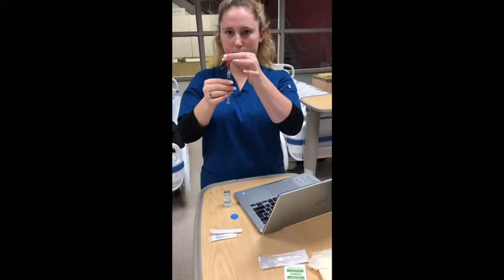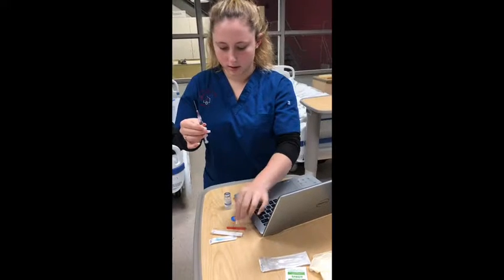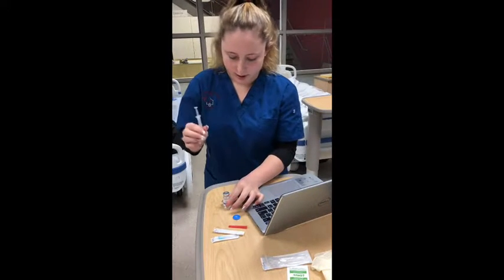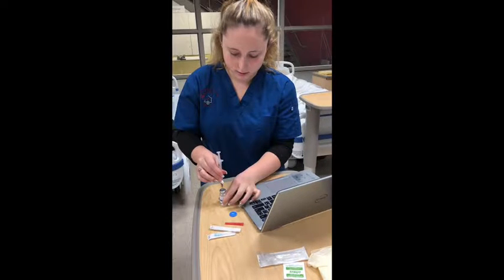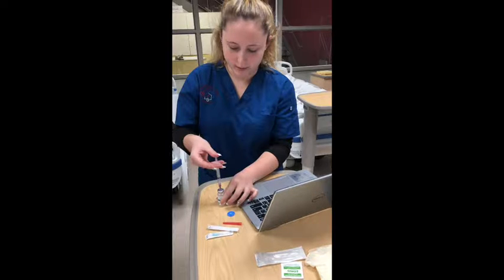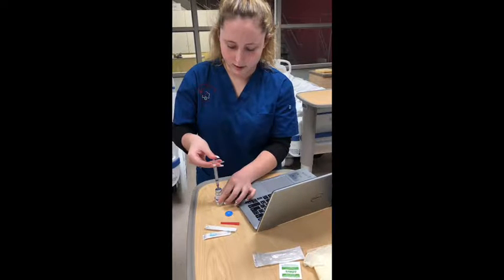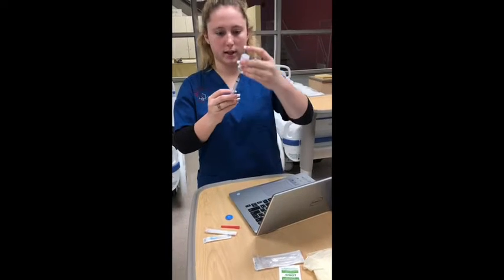I'm going to carefully remove the cap on the needle. And I'm going to insert it into the vial. And then once it's in, I'm going to push the 1 milliliter of air into the vial and turn it upside down.